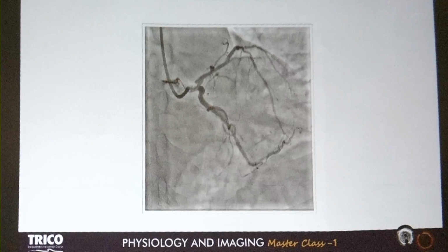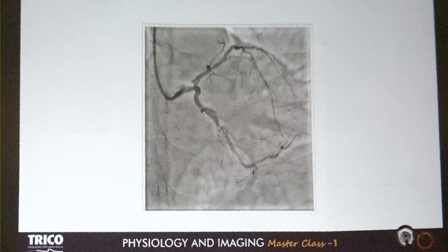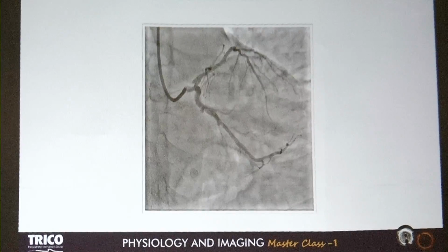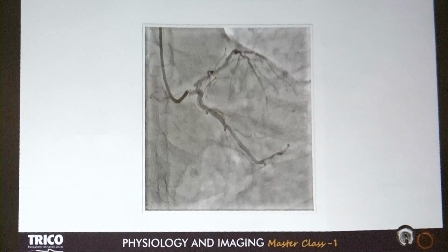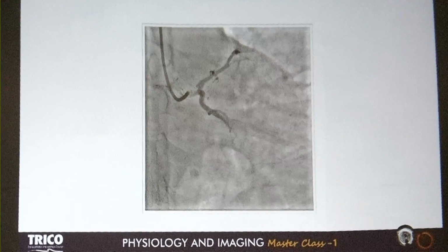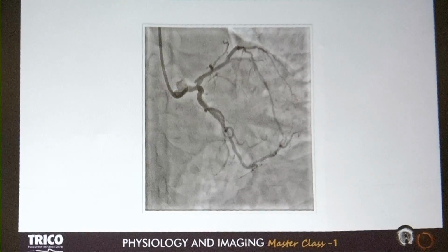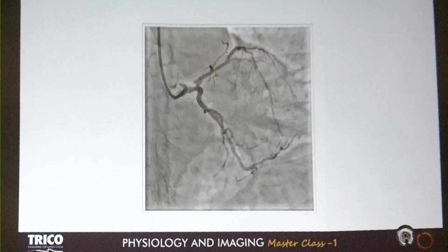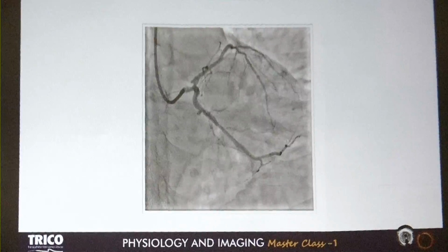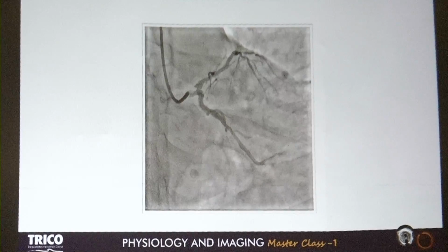Might be stent migration, but it is too late to get a migration. But it is definitely not migration, Ajay, the stent is very snugly fit there. Just at the edge of the stent there is an aneurysm. We don't know whether it was there before or not. It was done somewhere else. So, Abhiram, any comment? Do you know anything about stent sizing? Sometimes if stents are undersized or there's malapposition... No, nothing was available. The patient presented to us for the first time, and we are not aware of that data. Samir, do you have any idea?